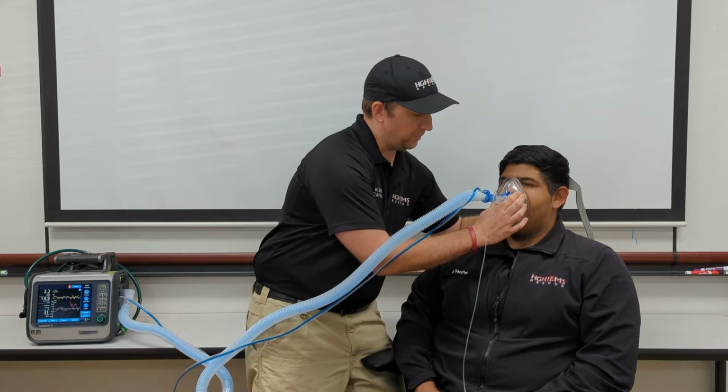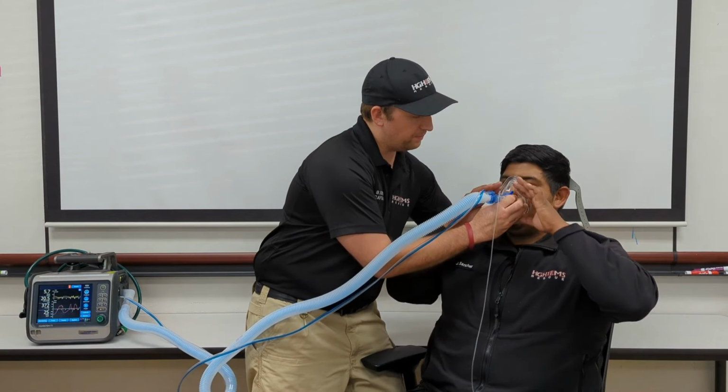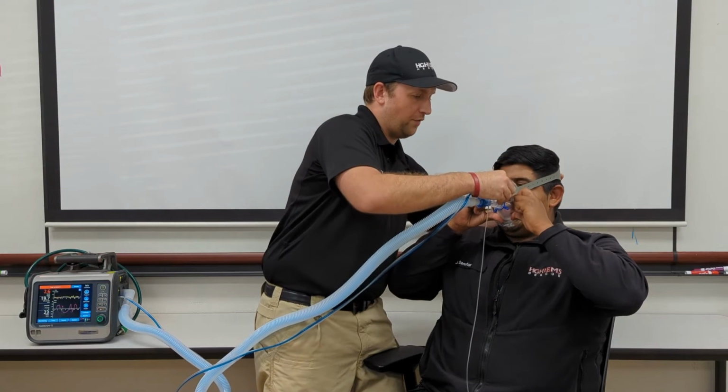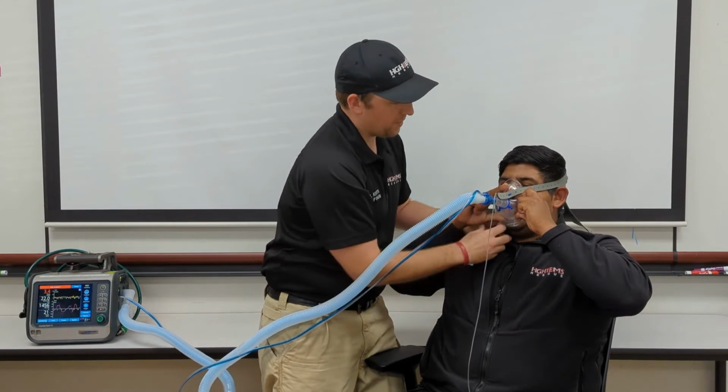How's that, Mr. Sanchez? Are you able to tolerate that? Yeah. All right. Can you grab the mask that we talked about? Perfect. We're just going to start off where it's lightly snug. Cross pattern.